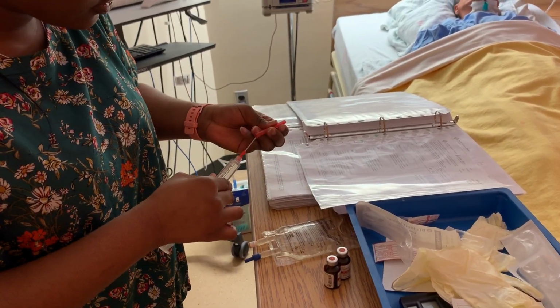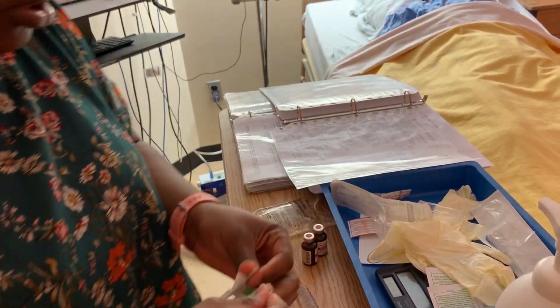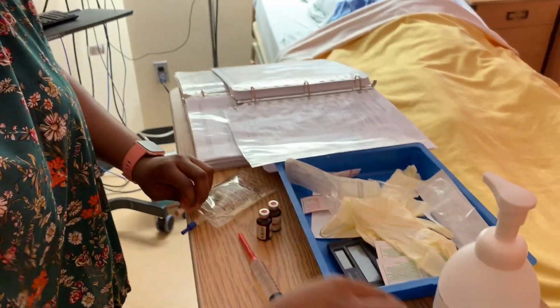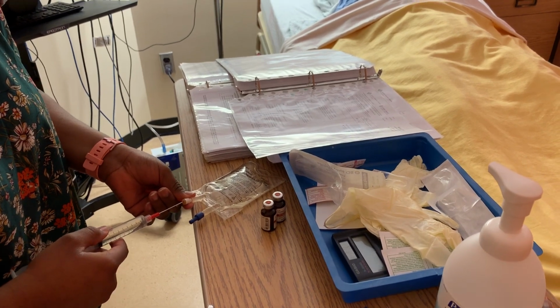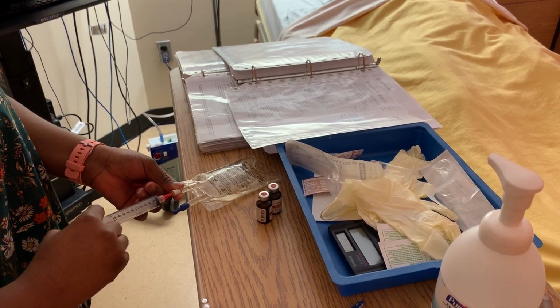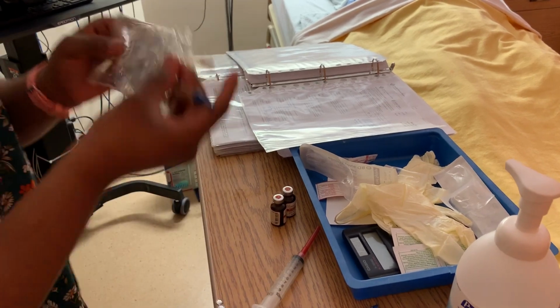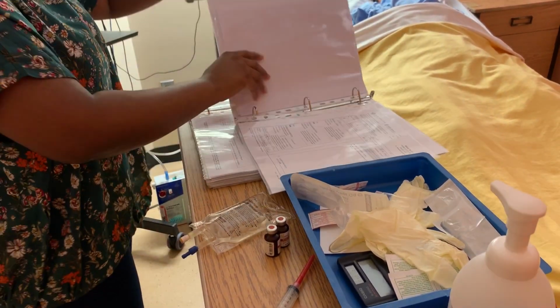So first of all, before I dilute, I'm going to alcohol swab again. So I have alcohol swab. So now I'm going to inject this. And then I'll run it for 15 milliliters per hour. So I'm gonna mix it up, and now I've mixed it up, so I'm gonna put it in.